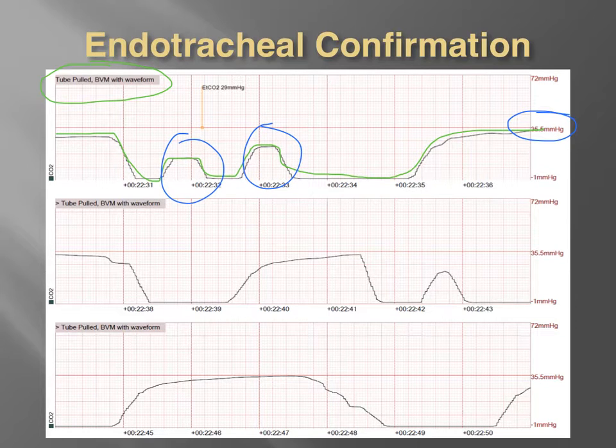Okay, now let's move on to the next row here, and we can see that some of these waveforms are not very pretty. Like I said, it might be partially them breathing, or it might just be poor handling of the bag valve mask. In other words, you might have some leaking around the face, because you don't have a good tight seal, or the fact that sometimes we lose our grip on a bag valve mask. Remember, there's a bunch of vomit and poop around. It's very possible the bag valve mask was slipping out of the caregiver's hands.